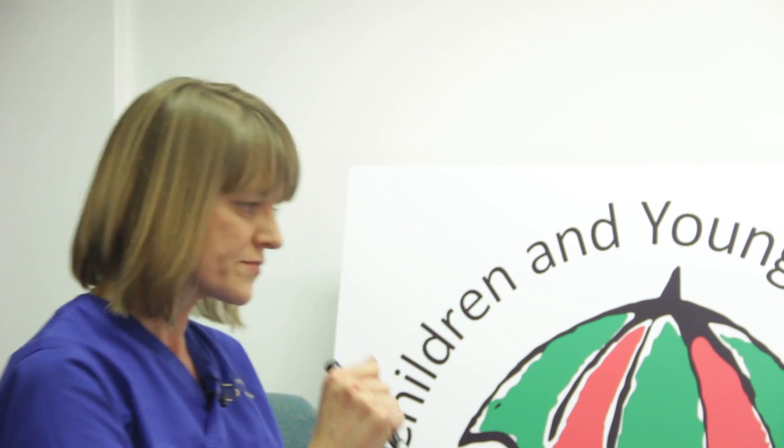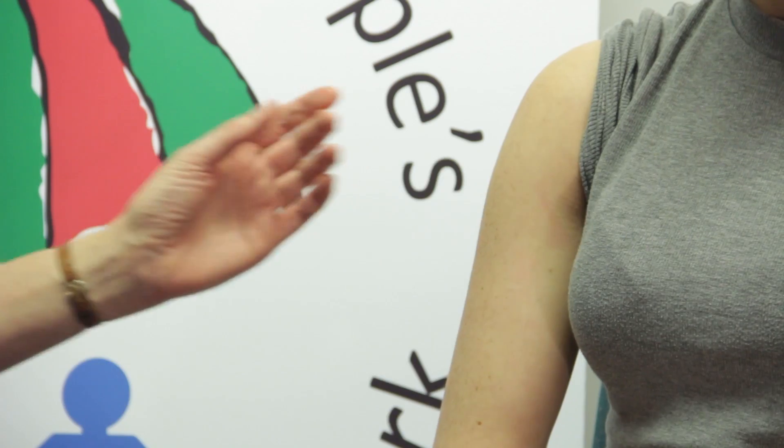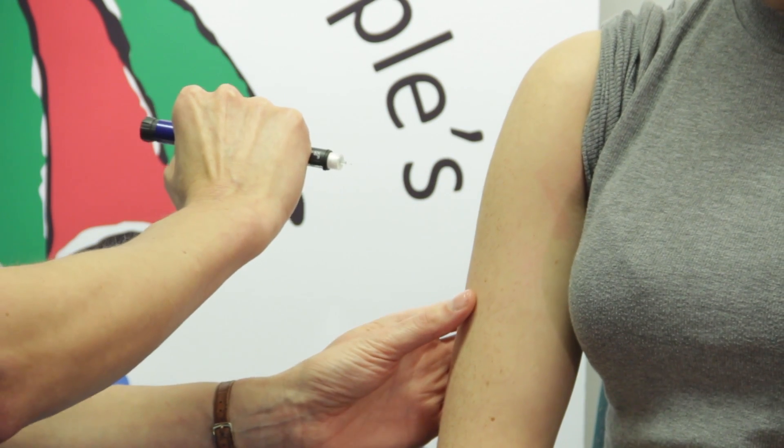Insulin can be given into the top of the arm, the top of the leg, the tummy, and the bottom. Your diabetes team will guide you as to where the best places are for you to have your insulin injections. I'm going to give it into the top of the arm.